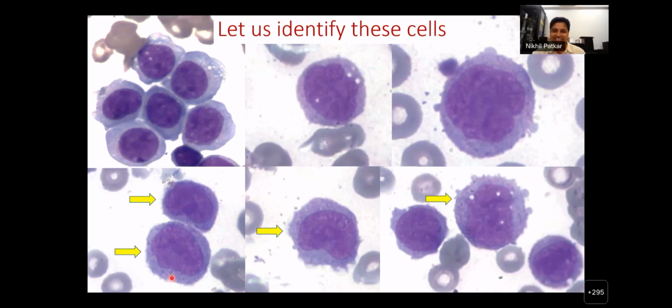Once again, because it's a slide seminar, you can say this with confidence, but in real life, if you are faced with these cells, it is often difficult to distinguish what is a blast from what is a promonocyte, from what is a mature monocyte, to what is a developing or immature monocyte. So it's not always that easy, but this is a good image to remember.